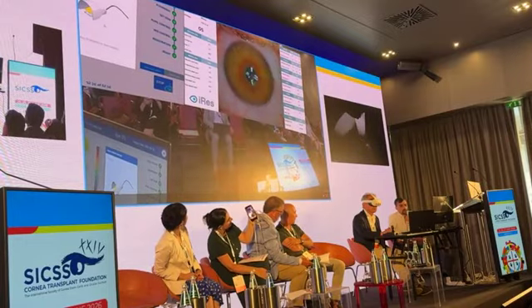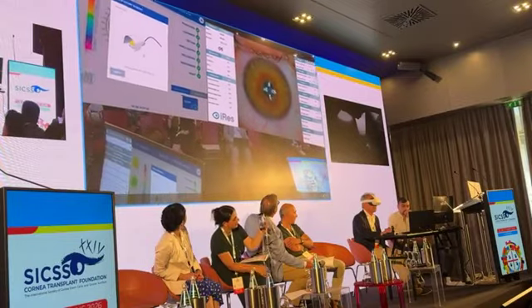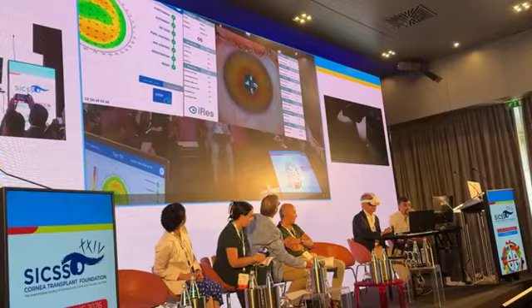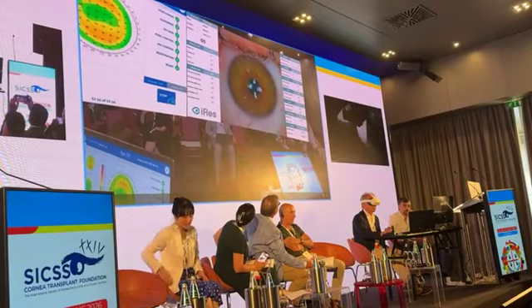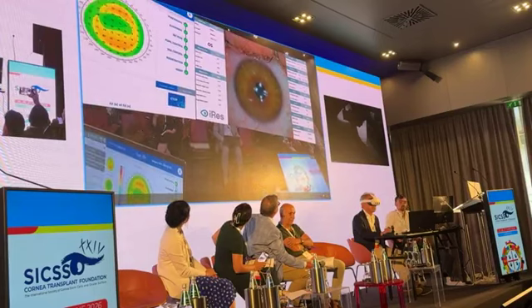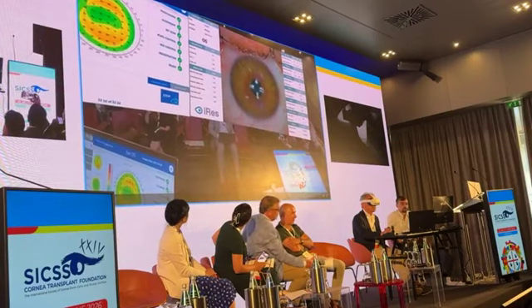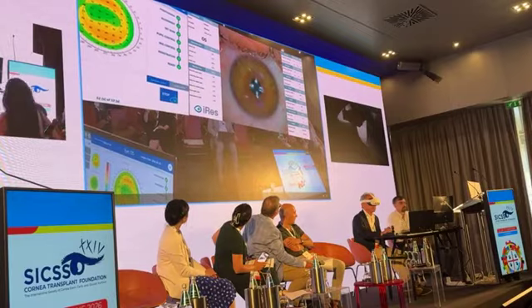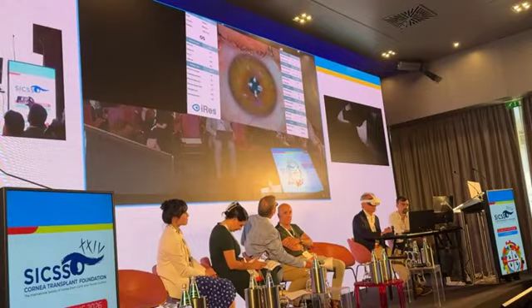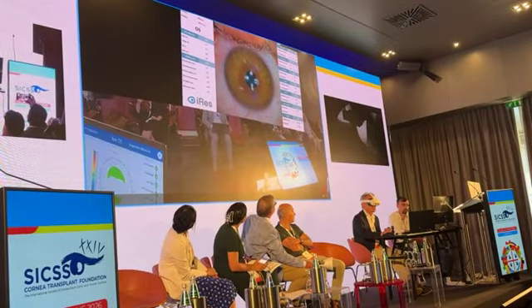You will see now that the laser will start working very gently, at just 5 Hz, in the most delicate region. Then the speed will increase in order to cover the entire area of the treatment in 52 seconds, up to 2 kHz. You see, the surgery started.